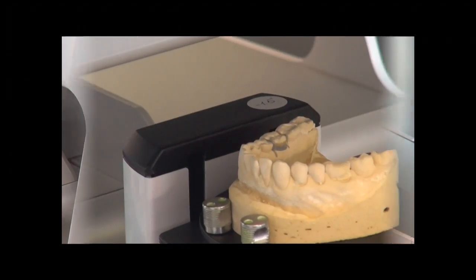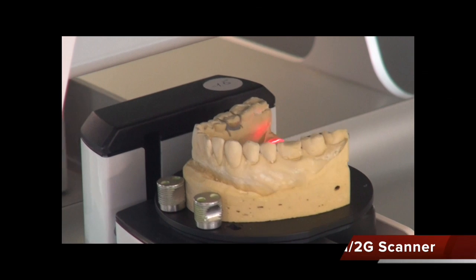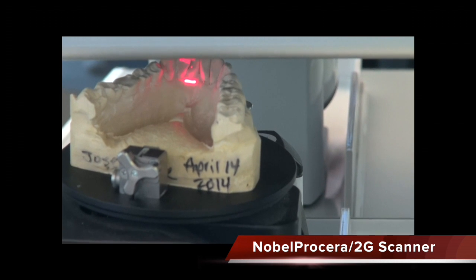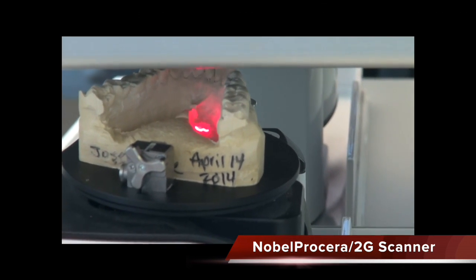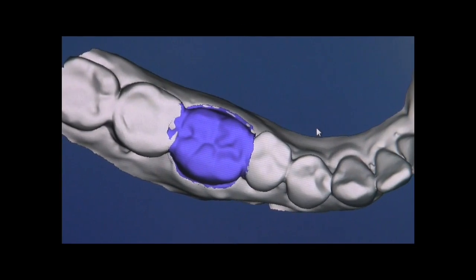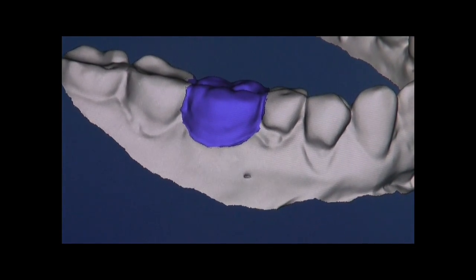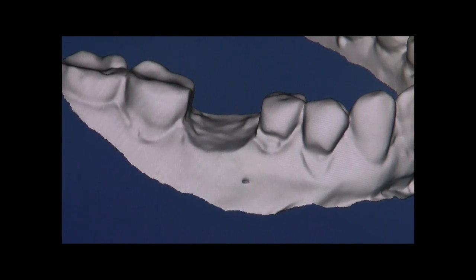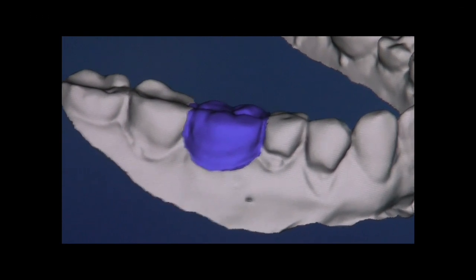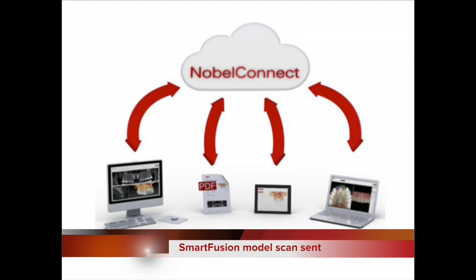Once we have the CT scan, an impression is taken and sent to a dental lab to do a scan using the 2G scanner, which is the Nobel Prosera scanner. This scanner is going to scan a particular model shown here, so we will be able to have the before and after of this particular situation. Using the system of Nobel Connect, this can be sent back to the dental office and then Smart Fused into the CT scan.